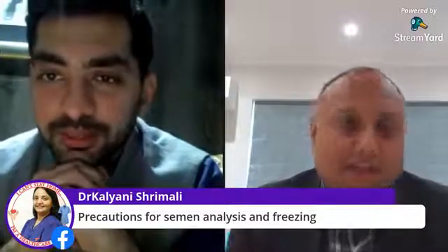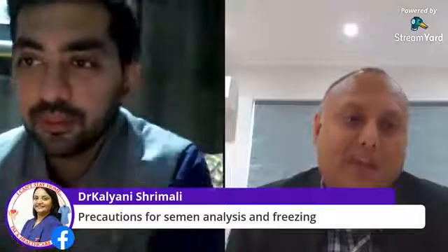So theoretically, a good lab should have a startup and a shutdown protocol in this pandemic scenario. At startup, everything gets wiped down, including your equipment and your microscopes. At shutdown, you do the same, and in between procedures, you also decontaminate. It takes 5 seconds to just wipe it around.